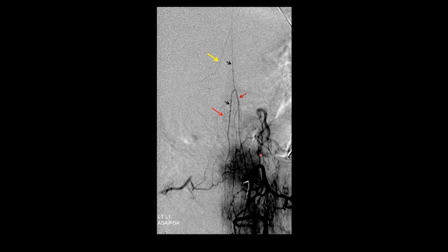This image shows well the concept that the radiculomedullary artery supplies the anterior spinal artery, but there are potential anastomoses with other radiculomedullary arteries. And here, if we inject hard enough in this vessel, we can overcome the pressure from this particular other segmental branch and this particular radiculomedullary artery, so we can opacify it. But this, again, is another radiculomedullary contributor to the anterior spinal artery.